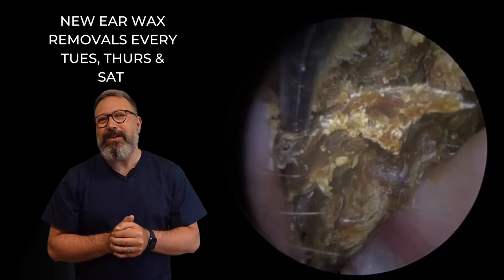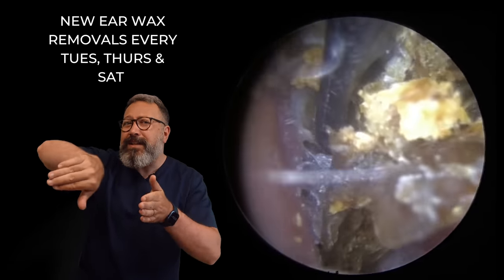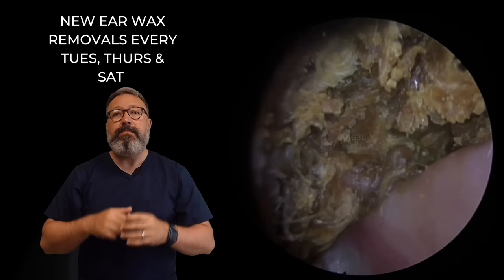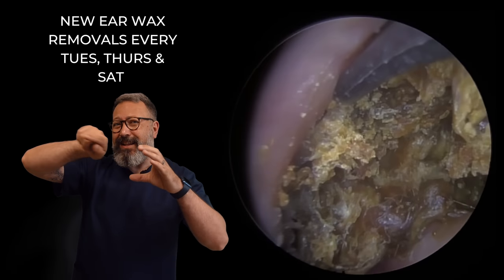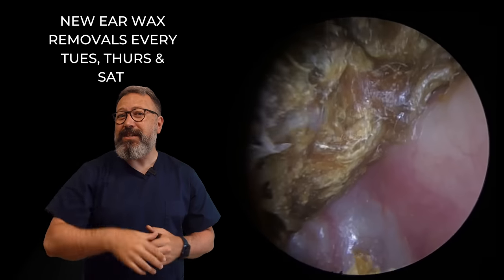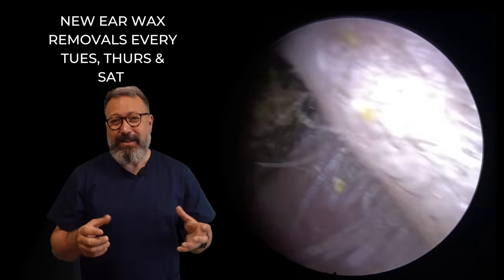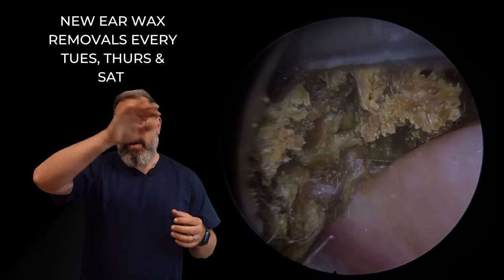You can see what's going on here — we've just got this whole section of dry skin and wax, and it goes around and into the cavity. I want you to imagine the ear canal, and then imagine a ledge that comes over off the side. That whole shape is going to be the ear canal shape in this case. All of this dead skin goes up and onto that ledge, so it goes back quite a way, which is why it's holding on so tightly. You can actually see the eardrum there at the bottom of the screen. When you see how much came out of this ear canal, you'll see just what was hiding in these cavities. It goes all the way around and over the top.